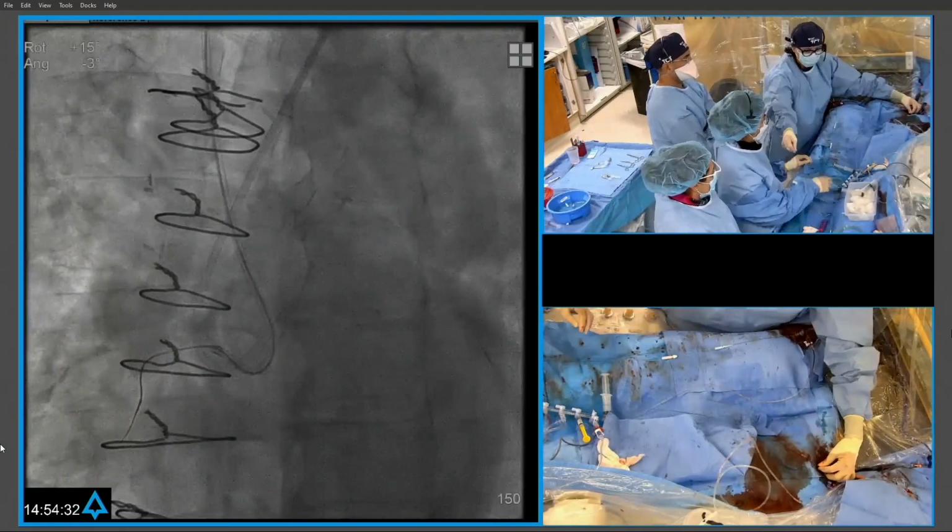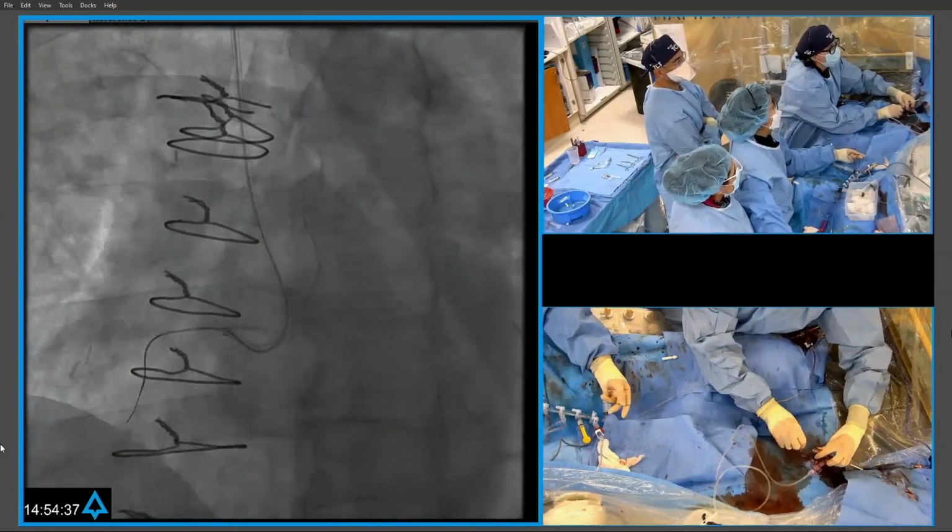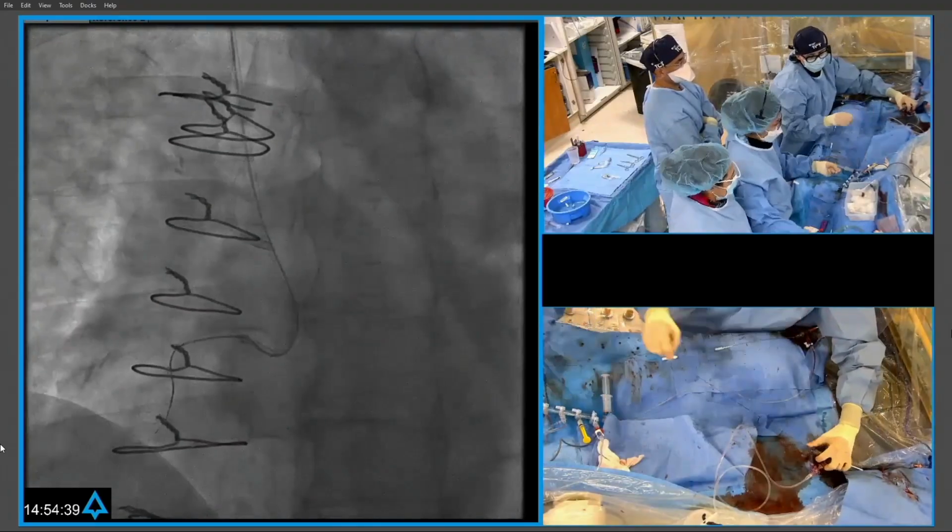It's not an exact science. So basically you take the coronary wire. But the main thing is to change, because what we're doing is not working. Back end. Okay, thanks, guys.